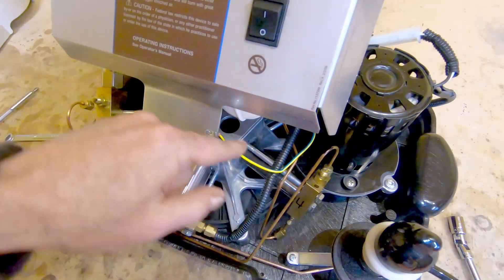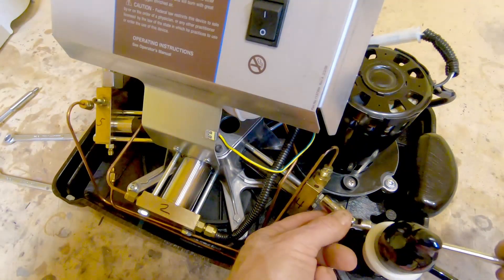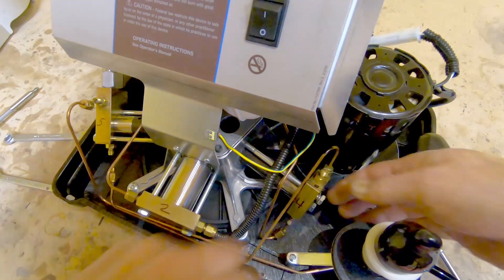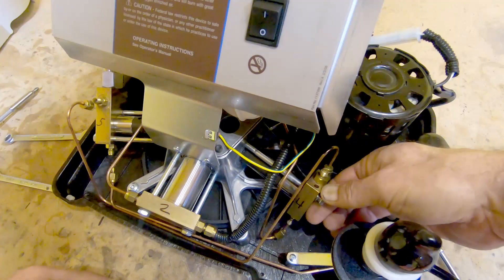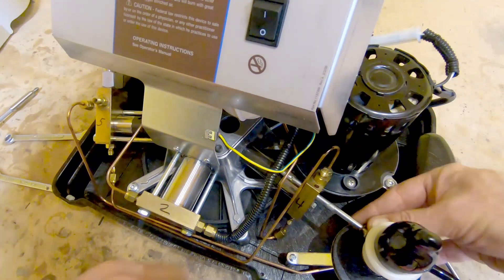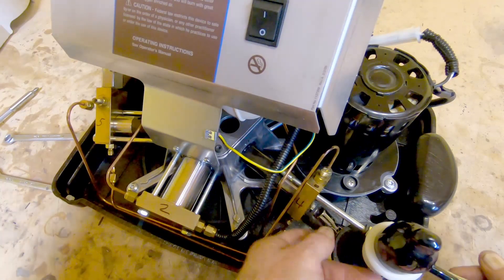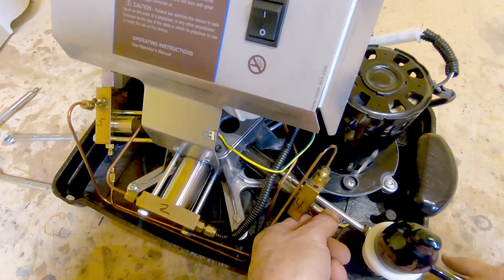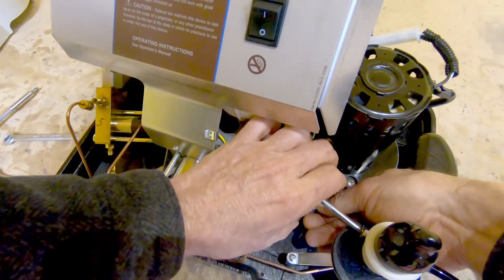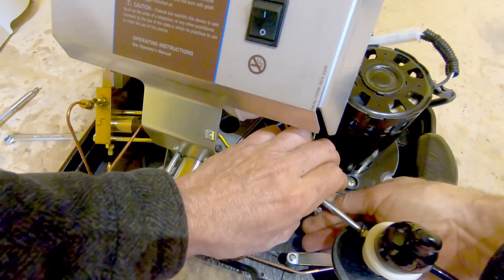The bolts here are just regular quarter-twenty hex head standard bolts, and I'm using a flex drive to get them loosened. As with everything in this machine — and actually I think anybody that works on motors would find it's common on just about anything — it's always hard to find room for tools to get your hand in.